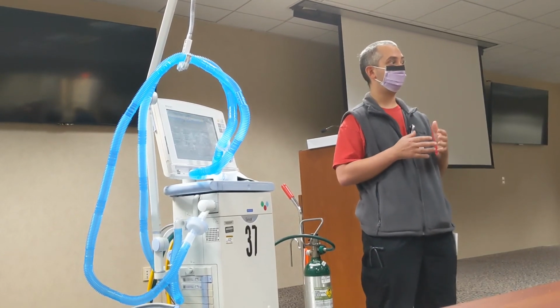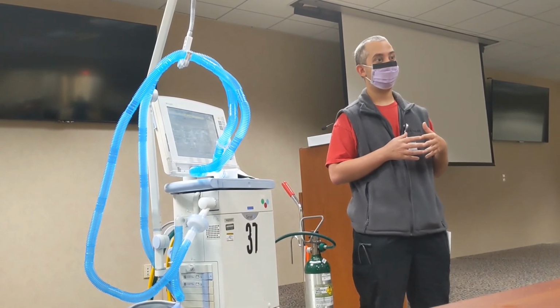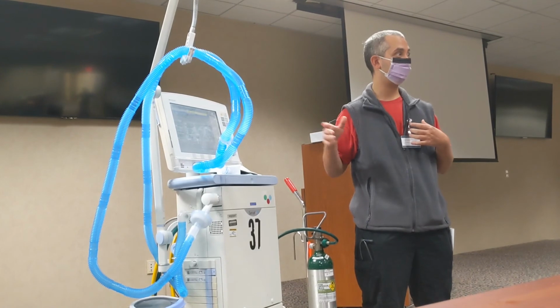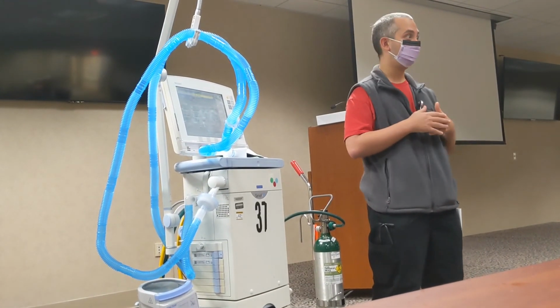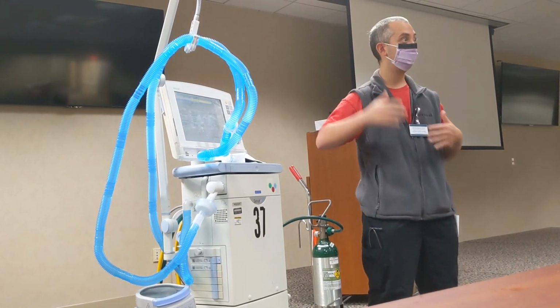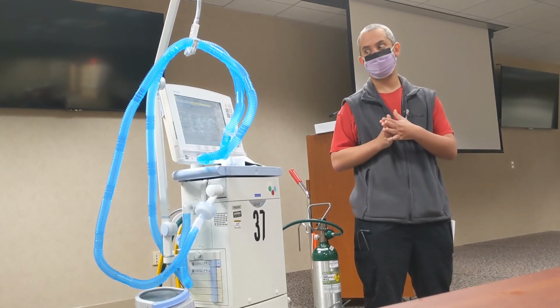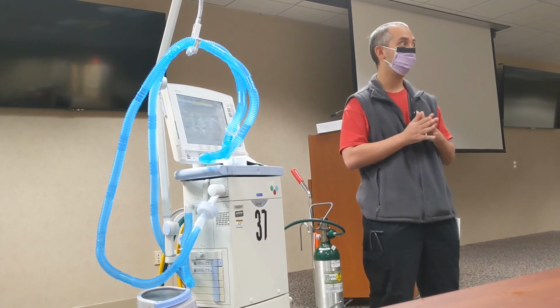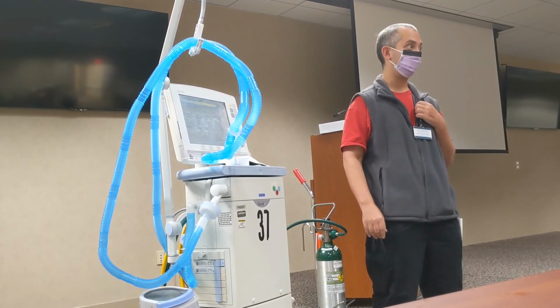And one of the problems with these people right up front is that you're really only getting volumes of 300 to 400 or so. And so you do have to go maybe a bit higher than you'd like with your P high to really recruit stuff up, or you just shorten your T high a little bit to make sure that you get the rate you need to still ventilate.